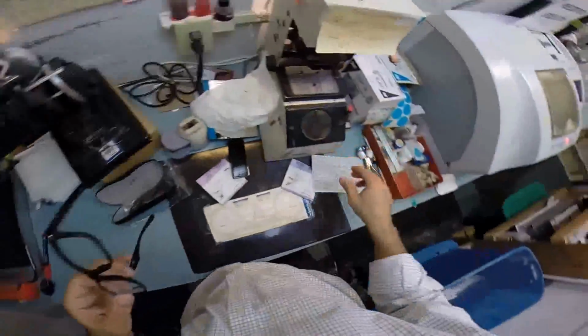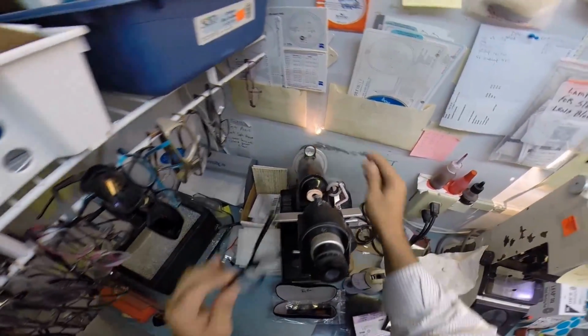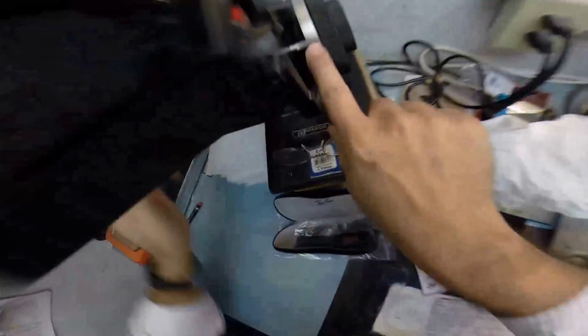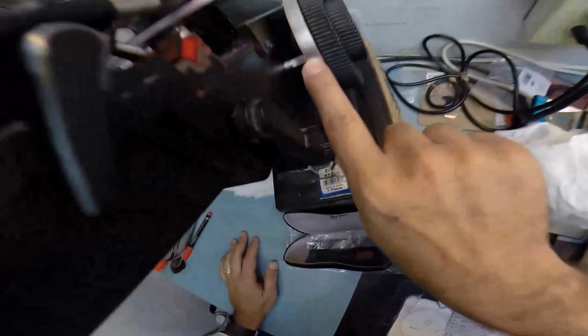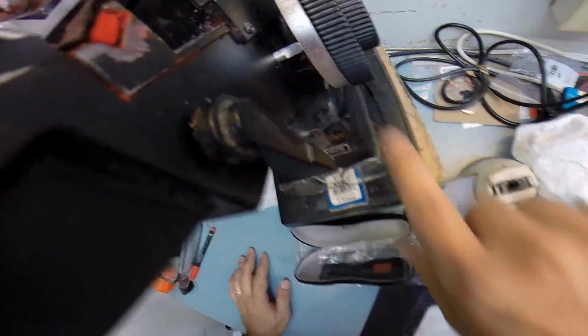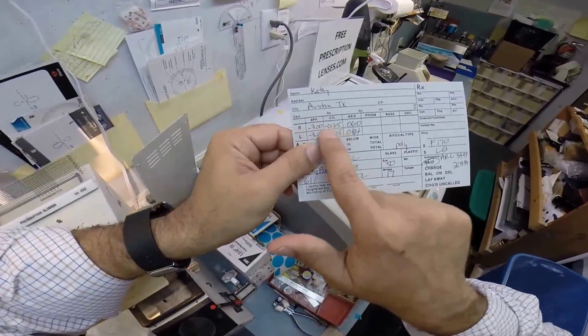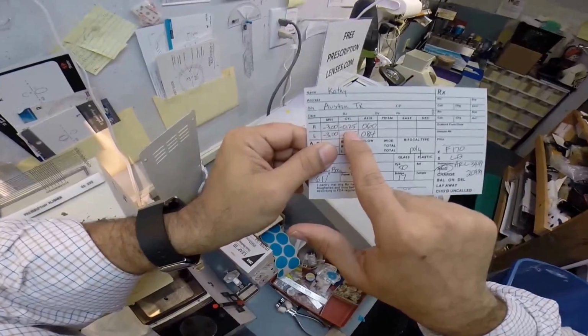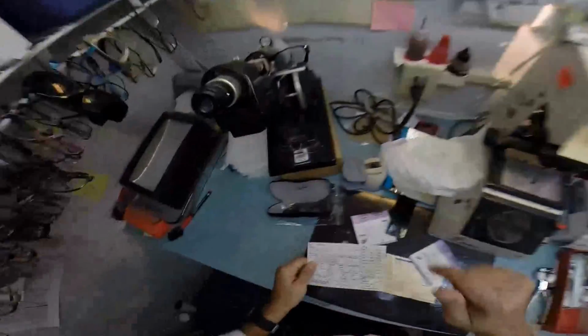So I'm going to put the lens back in my lensometer. I'm going to spin the axis wheel back to 60, put the lens in, rotate it, and I'm getting -3, so that is cut perfectly, and you have one step of astigmatism correction, which leads me to -3 1/4. Even though I said 3 and minus, we end up with 3 1/4. Remember high school algebra, we have two minuses and you add them together. So if someone owed you $3 and then borrowed another 25 cents, they would owe you $3.25. That is what we're getting, $3.25.